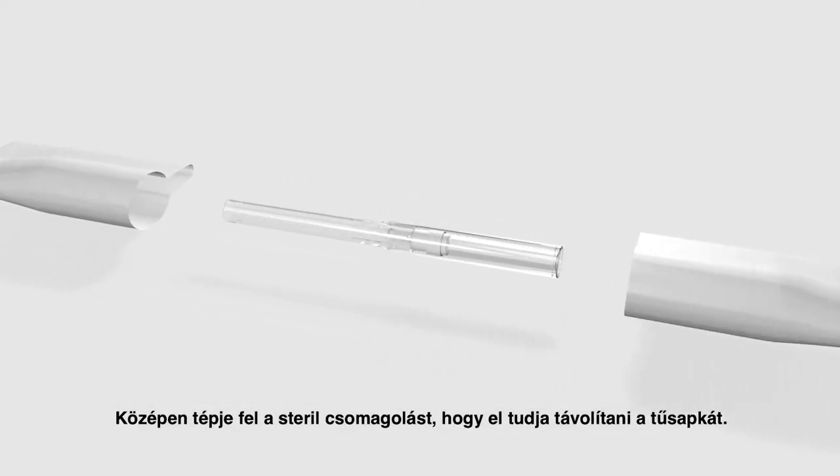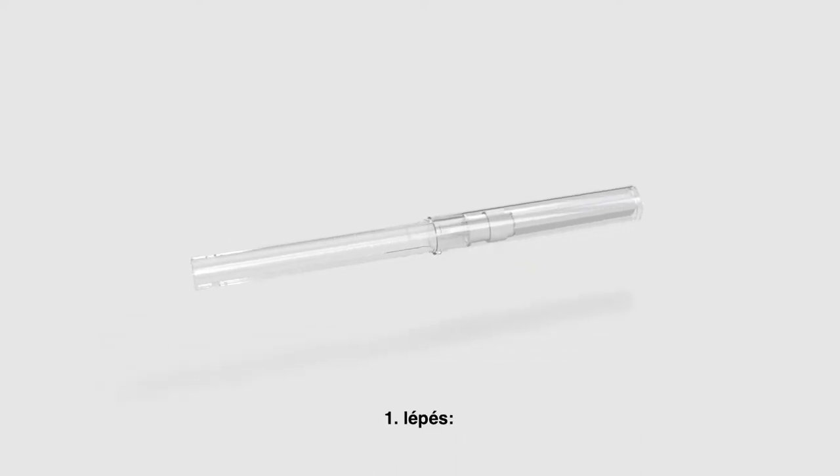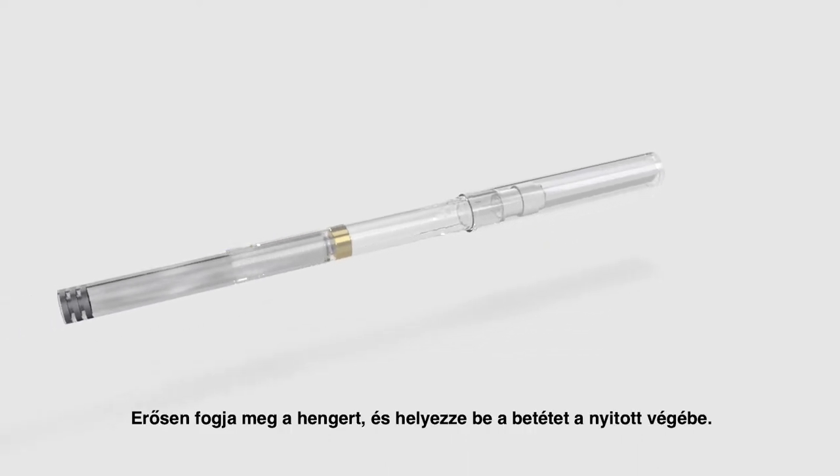Remove the protective needle by tearing its sterile packaging in the middle. Step 1: grip the barrel firmly and insert the cartridge into the open end.